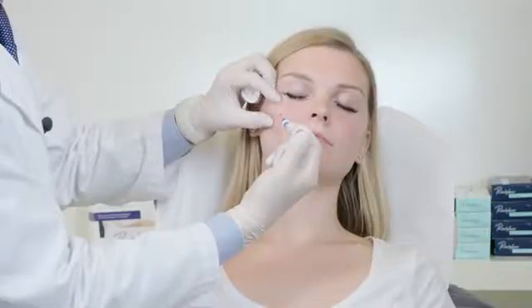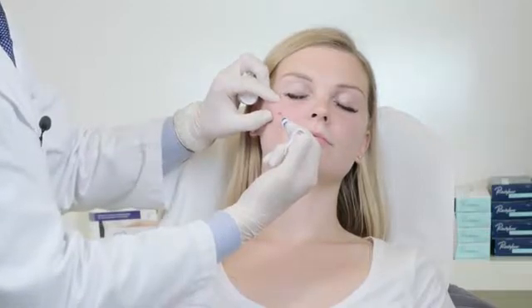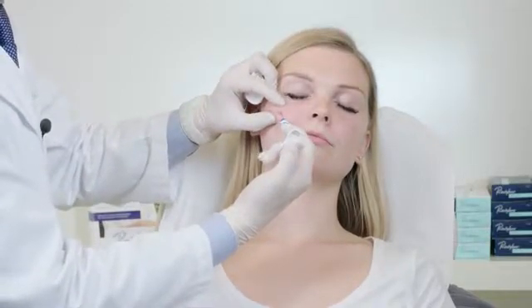In cases where you only intend to augment the lateral aspect of the cheek, you might use a different technique with a sharp needle directly onto the bone. Cassandra wants a natural looking result. I will show you how I inject the lip with the cannula technique, which is not always necessary, but is usually more comfortable for the patient. I prefer to have 4 entry points when I treat the upper and the lower lip, rather than one entry point over the modiolus, which reduces the need to break through this rather dense tissue and increases patient comfort.